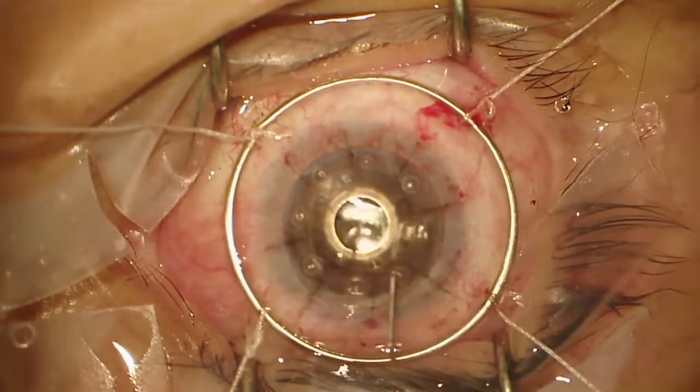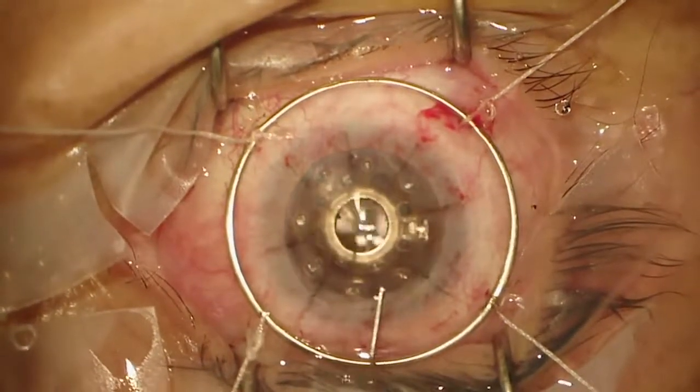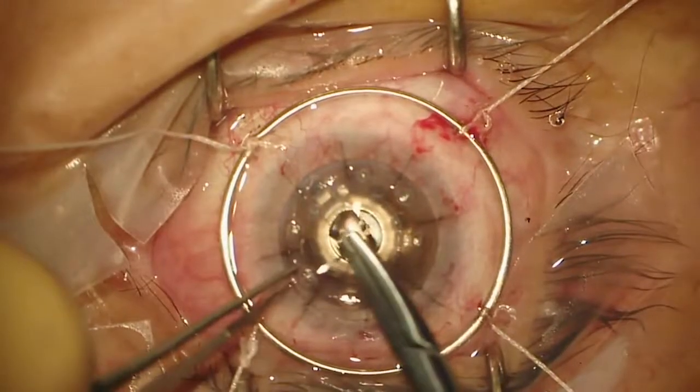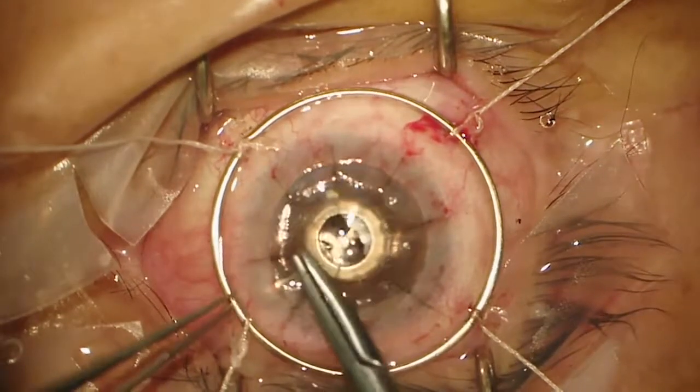So now we're in pretty good shape. We have a nice deep chamber. We have the intraocular lens in good position. We have a red reflex. We have a peripheral iridotomy. Life is good.